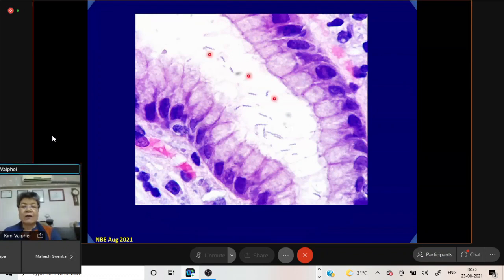And so this is another organism. This is stomach gastric pit, another organism. Any of you can identify this organism, which is slightly different, longer than the H. pylori, which we have, appear to be having this spiral, much longer. You may write it down in the chat box. I just want to test. But this is not H. pylori, but it is similar.